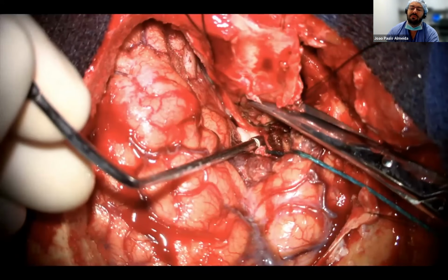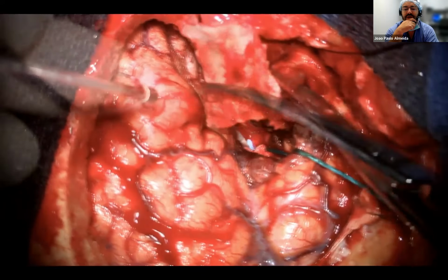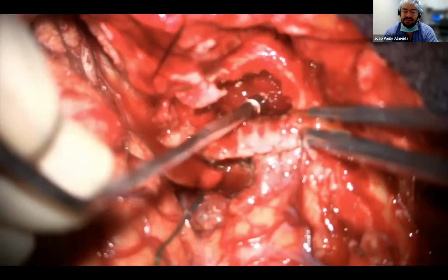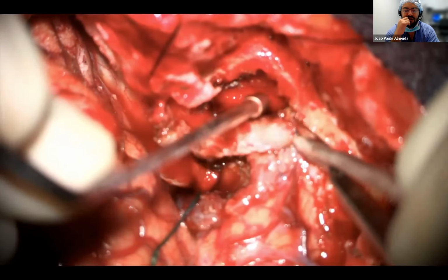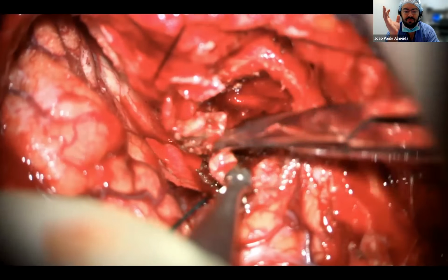And then we're going to be able, after all that maneuver, to start working around the vessels with a bit more space, or with not so much adherences. This is going back extradural and getting control from the feeders that will be branches of the meningoorbital and the MMA as well. And you see just removing all that tumor in close to the temporal pole.